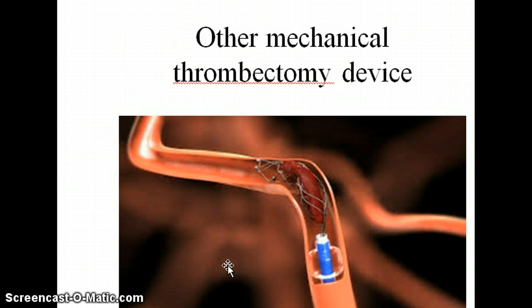Then there's the category of other different types of mechanical devices. This one has a kind of a weird shaped tip to it and it spins around to grab hold of the thrombus and pull it in.